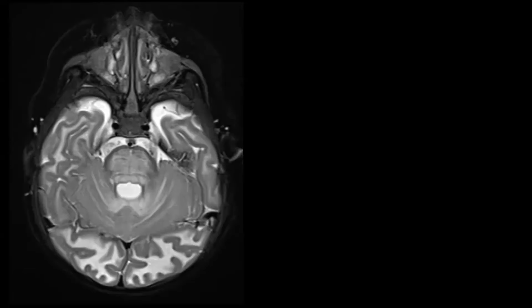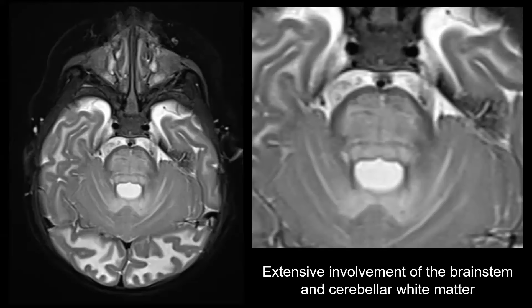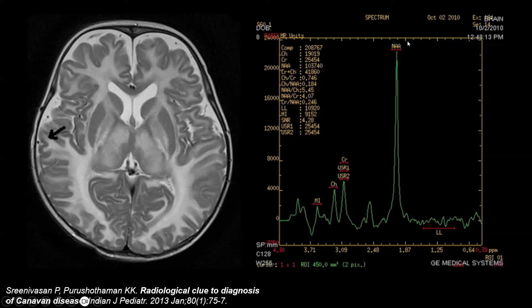Infratentorially in Canavan disease: there is diffuse involvement of the brainstem, very extensive, and also of the cerebellar white matter. This is very specific for Canavan disease. If you were to perform MRI spectroscopy, you would see a severely increased NAA peak. Canavan disease is basically the only disease you can diagnose with 100% certainty using MRI spectroscopy. MRI spectroscopy is a difficult technique because it rarely allows a specific diagnosis, but in this specific entity it is pathognomonic — there is no other disease in which you will see such a strongly increased NAA peak.